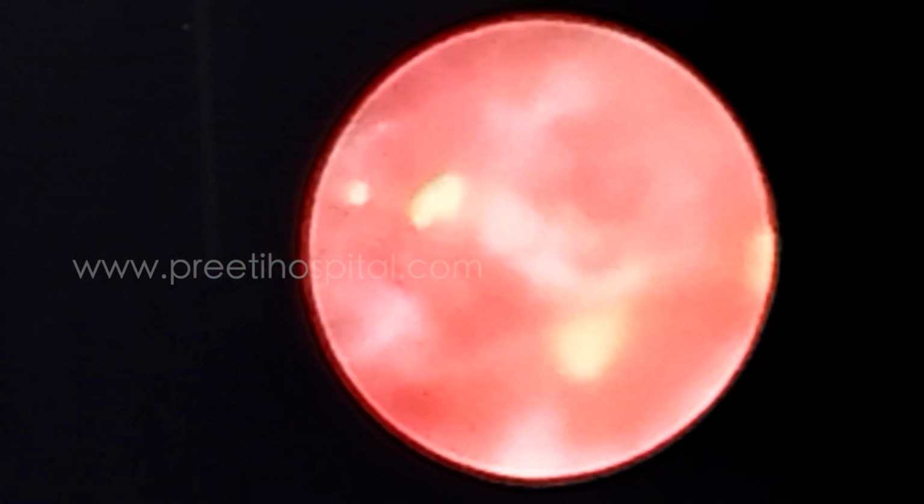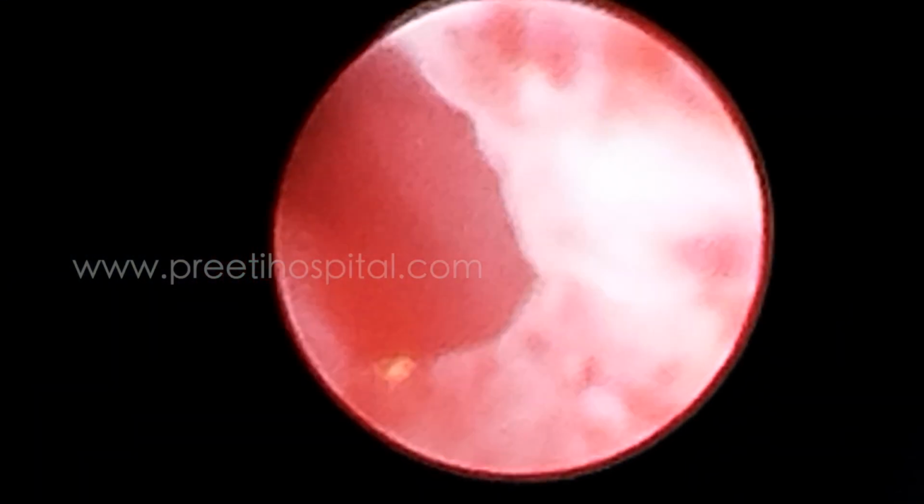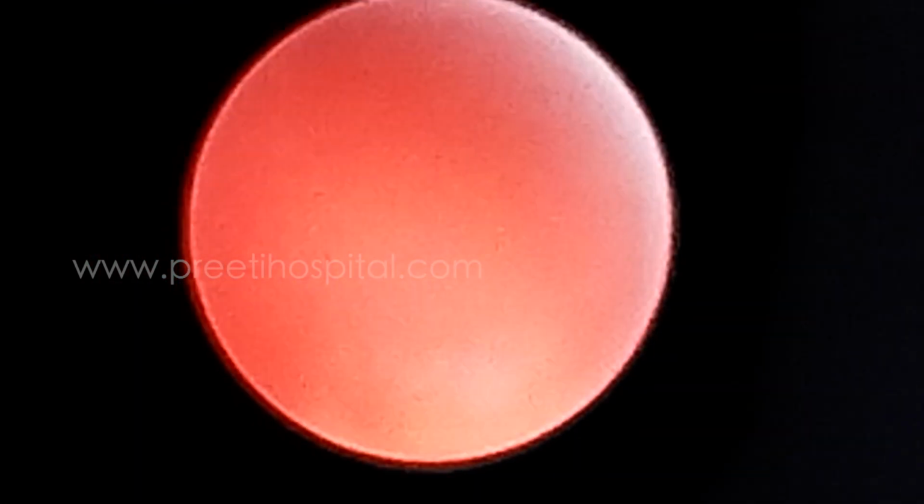We will take out. See, if you do powder, this type of powder sticking is very common, and it will cause stone recurrence. We have seen many times stones will form again. This is a bilateral stone disease. It has to be sent for stone analysis compulsorily. See the mucosa is a little bit torn here. And now other calyces we have to see. Nothing. See nicely. This is the infundibulum of the middle calyx. This is the pelvis. This is the infundibulum. You got the point? Now it looks better.